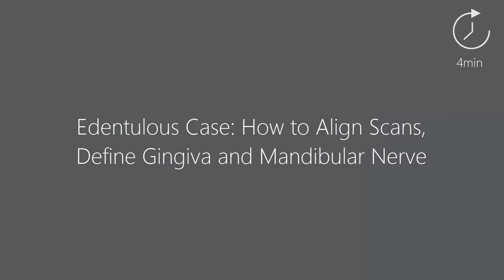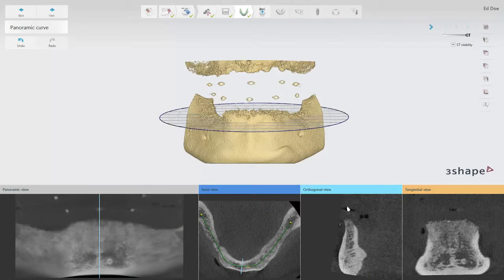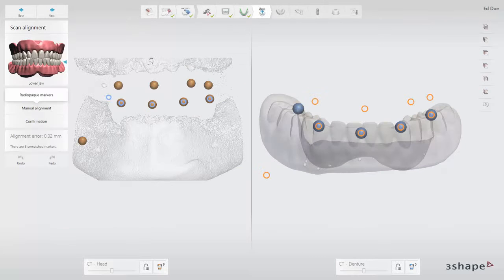In this video you will learn how to align scans, define gingiva and the mandibular nerve with 3-shape Implant Studio. Once the panoramic curve has been set, you can proceed to the scan alignment step.